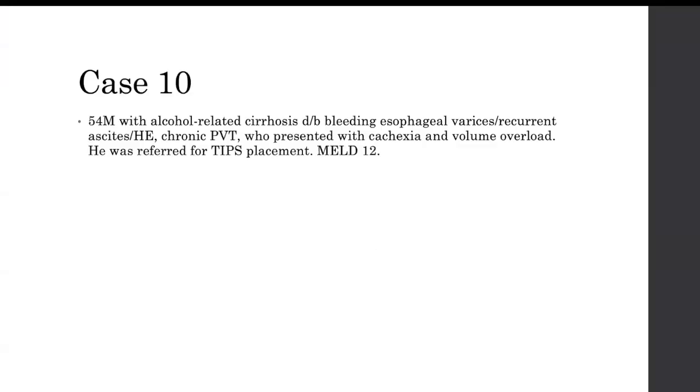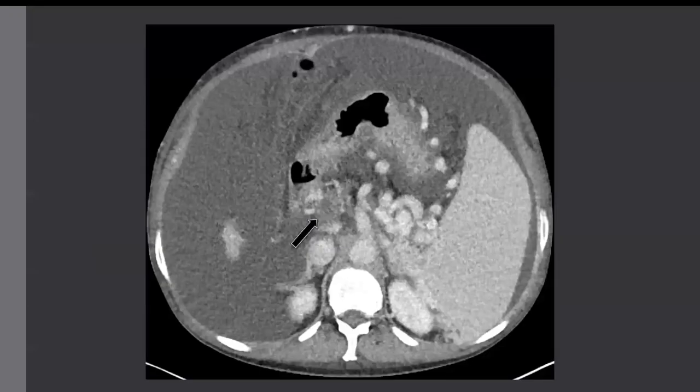All right. This is a similar patient, but in this case, it's chronic. So here, this is what's left of the portal vein. All right, it's chronic portal vein thrombus. You get cavernous transformation. Cavernous transformation is where the main portal vein or where the main vessel is occluded. And so the vessels in the wall, the veins in the wall of the vessel dilate up and become essentially the main functioning pathway to get blood past the obstruction.